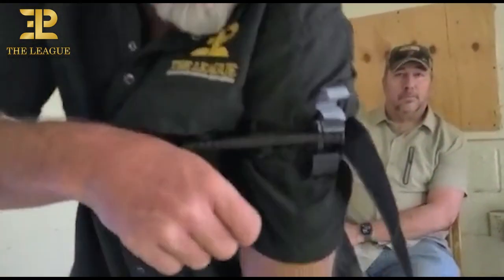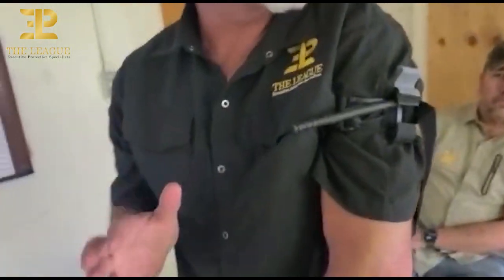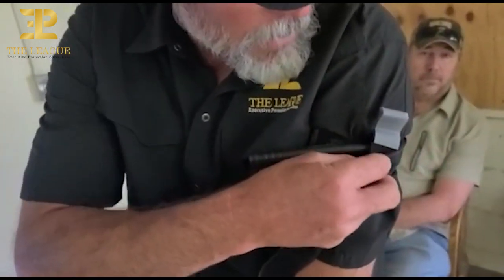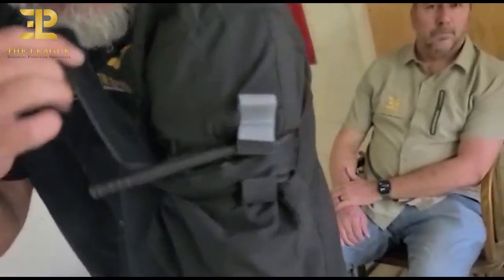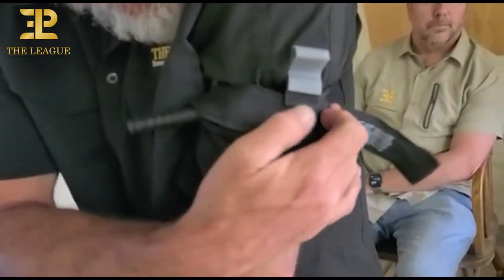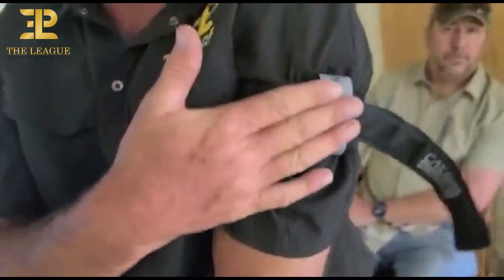Then we're going to lock it in once we're satisfied. Now, what we want to do before we touch this time tab — this gray tab — is route the strap through the buckle, around the windlass, and back through that buckle, and then pull our locking mechanism — the time tab — over.